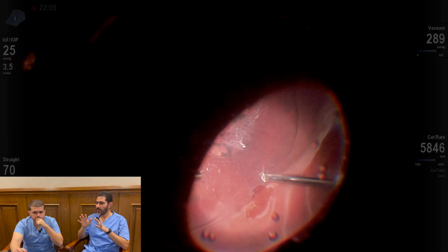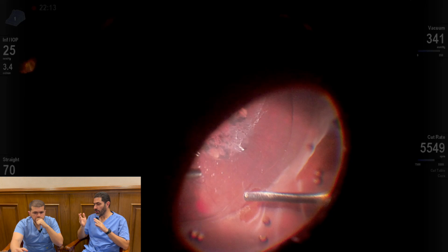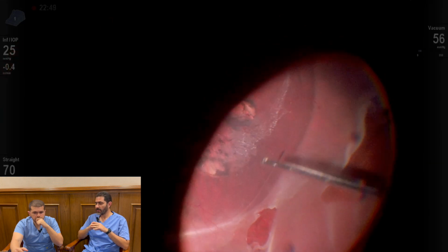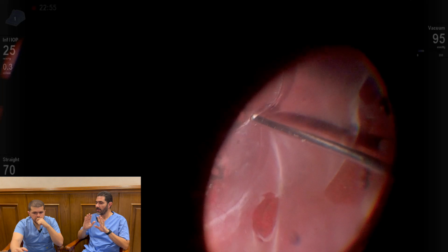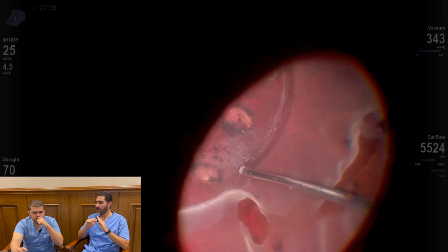Yes. So the other one, you can continue the surgery and the shaving of the vitreous while you are shifting to air. So if you are going to shift to air, not direct PFCL silicone exchange, this may make the retina much more stable, and the gel can be easily removed from these peripheral areas of the retina.